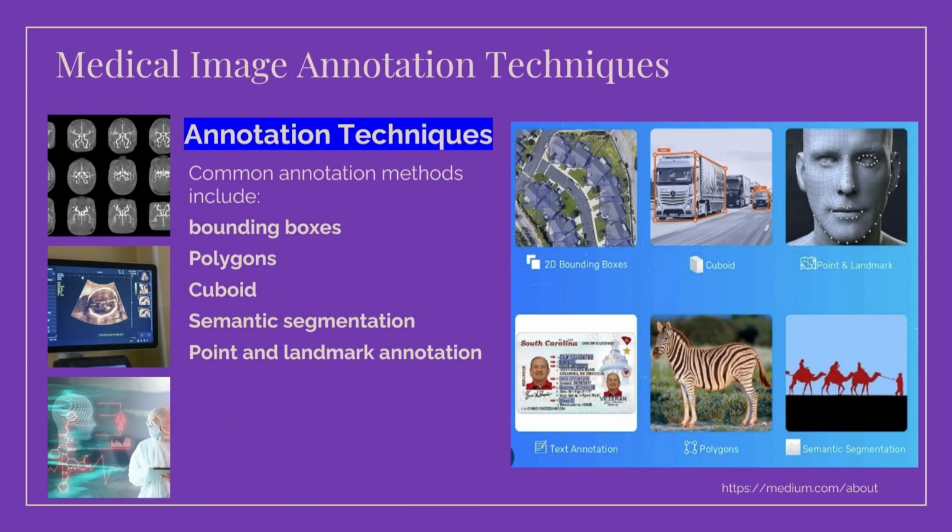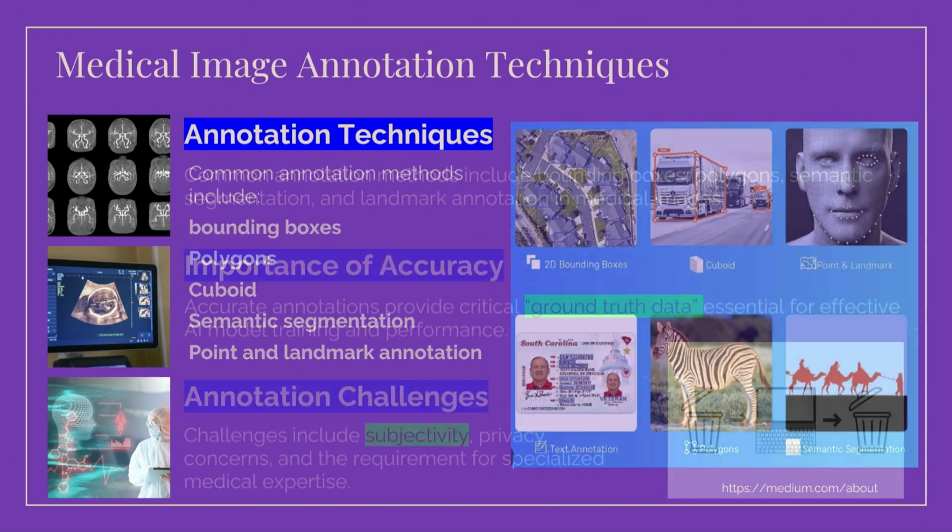So in the end, there is a lot of work you need to label and highlight, right? And there are a lot of different annotation techniques available to help speed up the process, but in the end the entire process still has a lot of manual work.